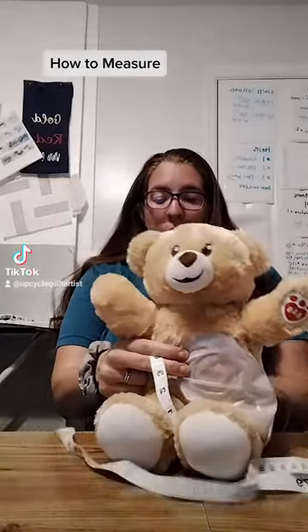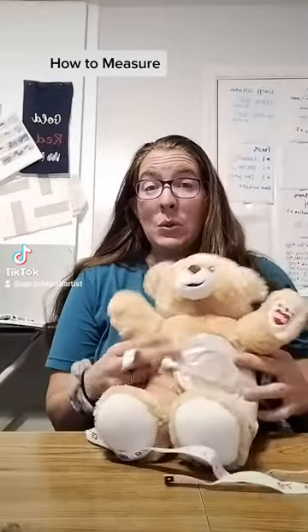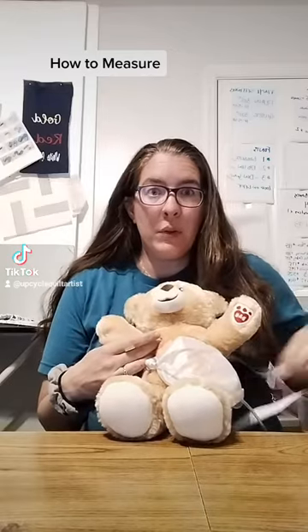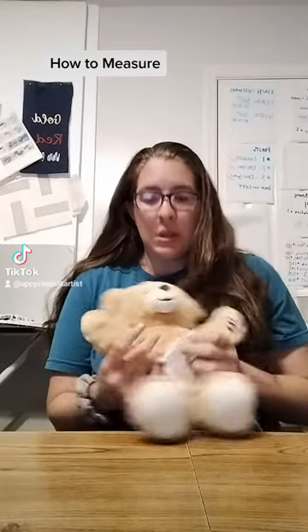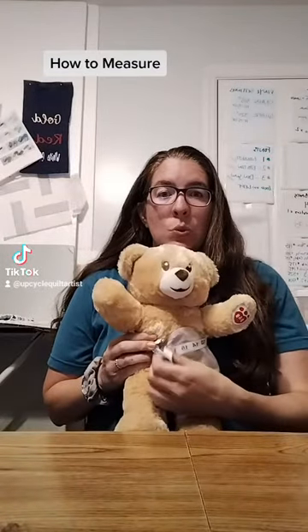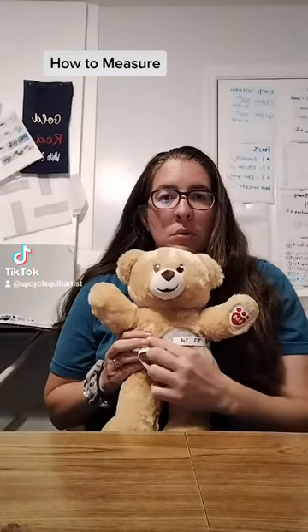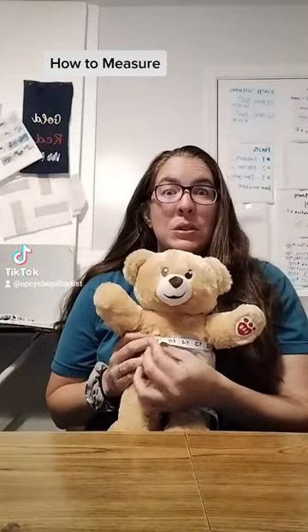Now if you know that you're probably going to wear them over clothes, then you can just measure them while they're fully clothed. No biggie. So you just wrap it around. Doesn't have to be tight — you just want to get a good measurement, but just don't squeeze it real tight. Just real nice and gentle. Barry: 16 inches.